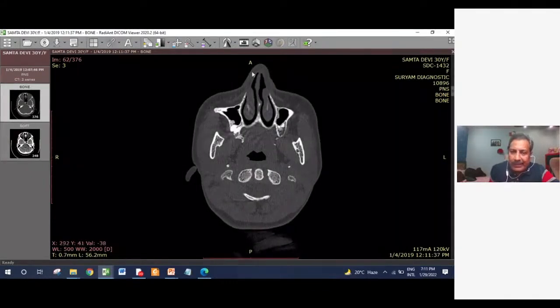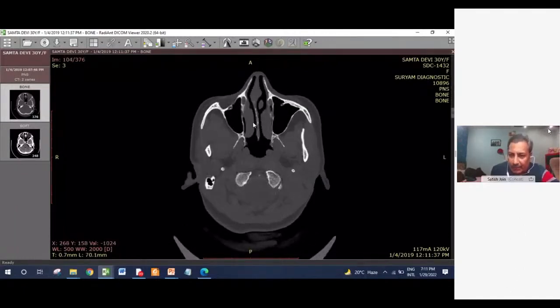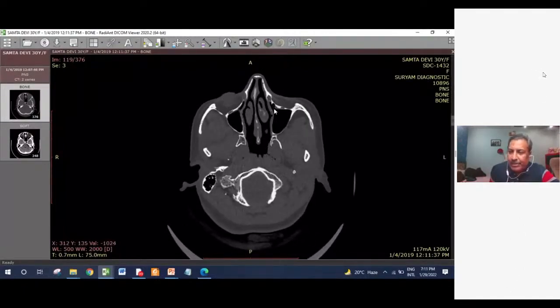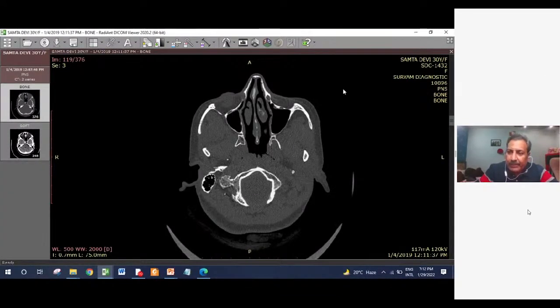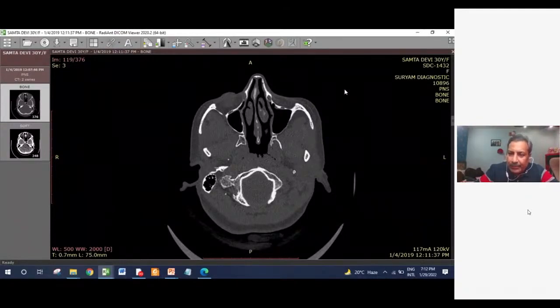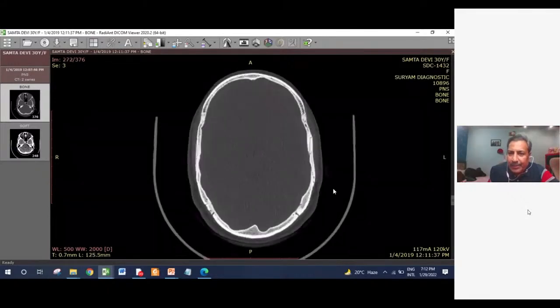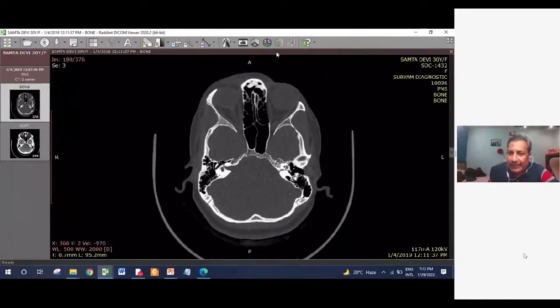Now, this is possible when I am getting it in a digital format, in the DICOM format. So ideally, when we order a CT scan, we should order it for our patient to get optimal information: CT scan paranasal sinuses 0.5, 0.6, 0.7, whatever your available machine can give you, 0.5 mm sections in DVD in the digital format or in DICOM format. The advantage is you get complete slices with you. You can see all fine details everywhere, that too in dynamic fashion.